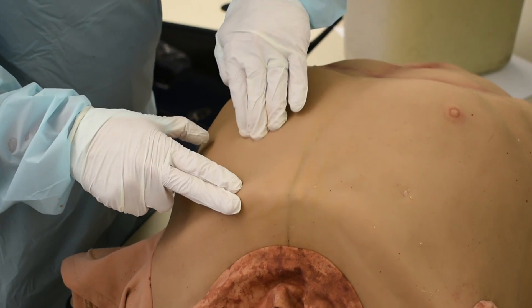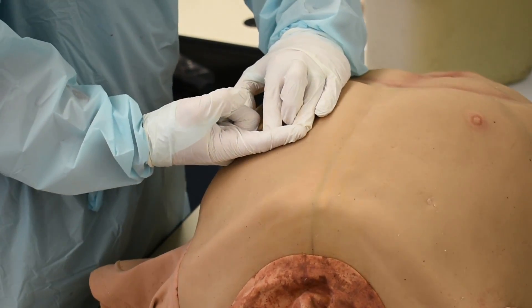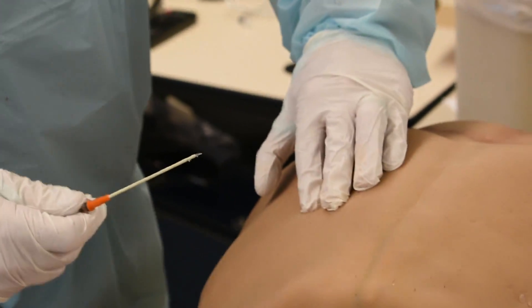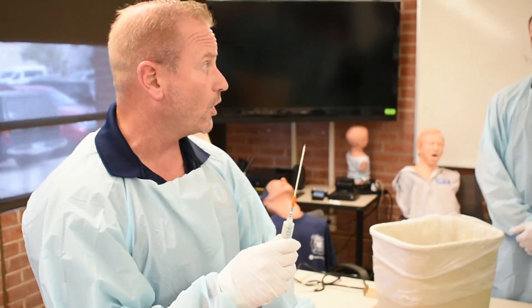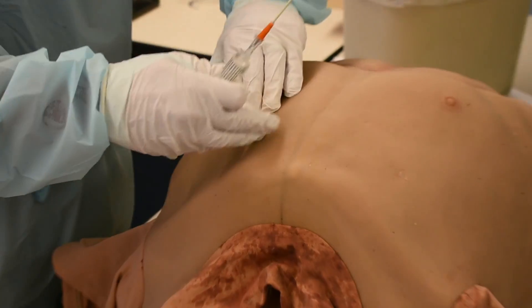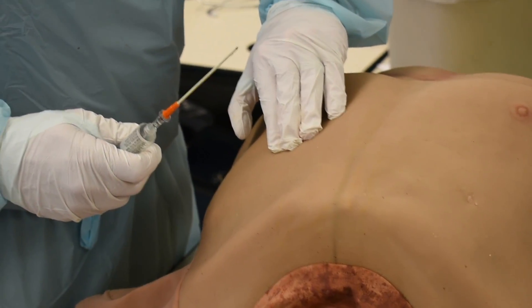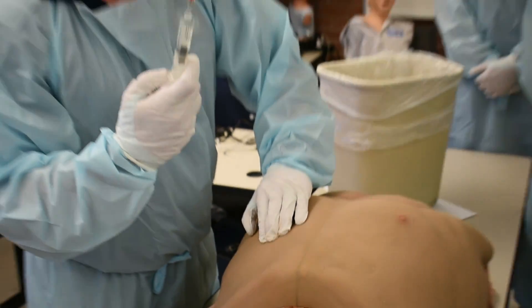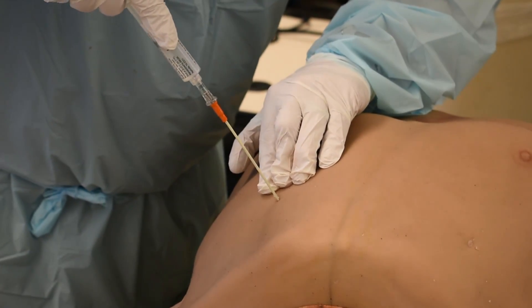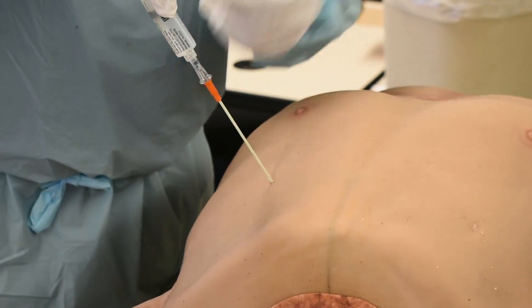I found his rib. I'm going to pull the skin down because we always need to be on top of the rib with our needle. We have our neurovascular bundle — artery, veins, and nerves — that run underneath that rib. These 14s and 12s have ginormous bevels on them. I would not want to be under this patient's rib and have my needle transect that artery, vein, or nerve — now I've taken a pneumo and turned it into a hemopneumothorax. I pull that skin down, make it nice and tight. With my right hand — my driver hand — I put my needle directly on top. Even if you slightly hit the rib, as soon as I let go of the skin, my needle is always going to want to go up, so you're going to be right on top of that rib every time.